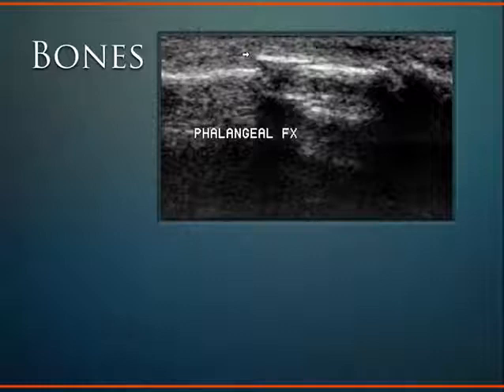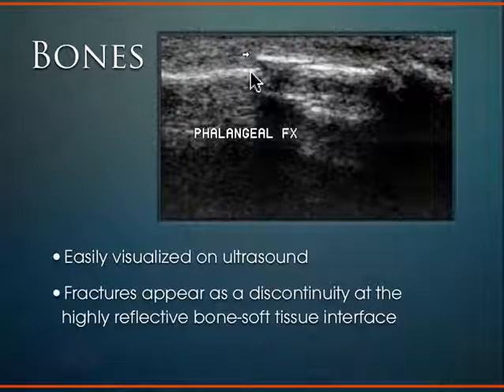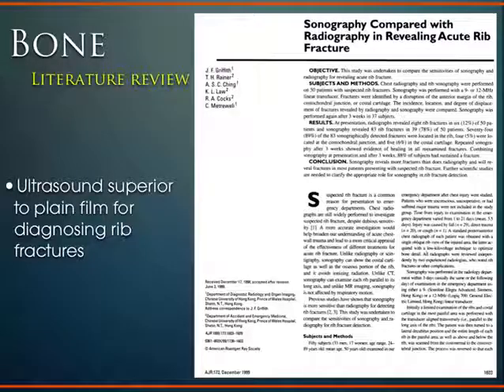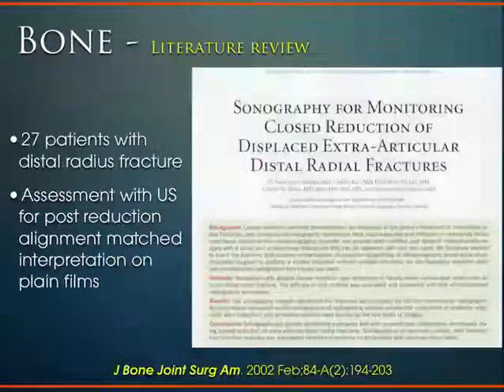Bones we can see very well — especially that superficial bony cortex structure — and consequently we can see pathology in bone as well, in particular fractures. As you can see on this image, this is the hyperechoic cortex line for a phalanx, and you see obvious disruption in that hyperechoic line showing a phalanx fracture. Very easily visualized. When looking for fractures, you basically see discontinuity in that hyperechoic line. A lot of people are studying this to make sure we're comparing to standard of care — x-ray, MRI, arthroscopy — and most studies are showing quite a benefit, showing it's either as accurate or in some cases more accurate than traditional modalities.